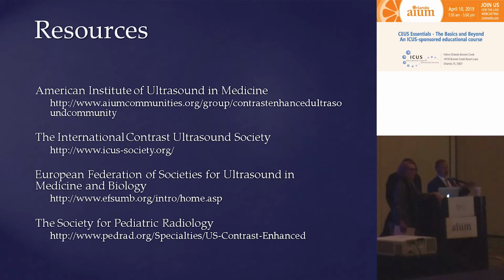We want to inject as many bubbles as we can and let them last for as long as possible. So we do a relatively quick injection over, let's say, 2 seconds, and then you flush it at about 2 mL per second. You don't want to do it little by little, because then you ruin your bolus and you're not going to have as avid an arterial phase contrast enhancement as you would with this technique. So honestly, this works just fine.